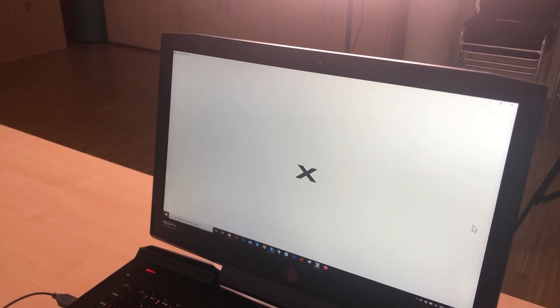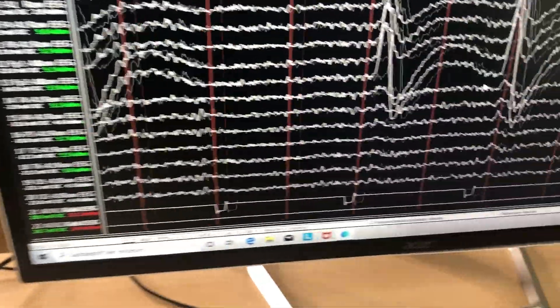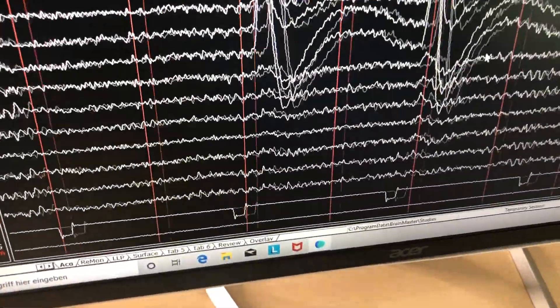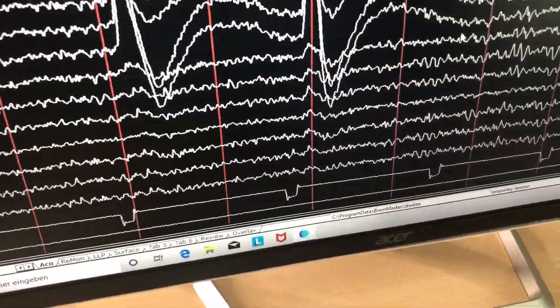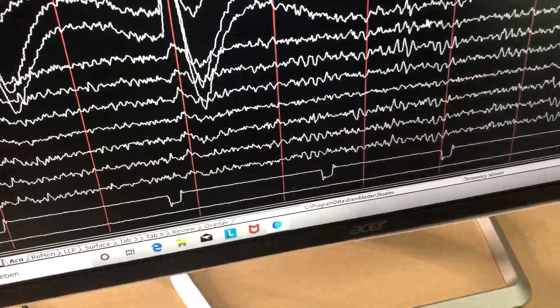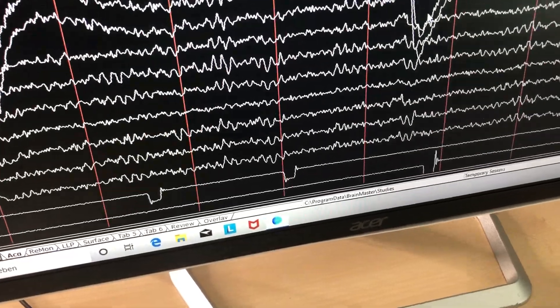And there are some artifacts in it, but the subject is also instructed not to blink too much. Later on, these artifacts will be taken out of the recording, or they can be processed via artifact correction programs.